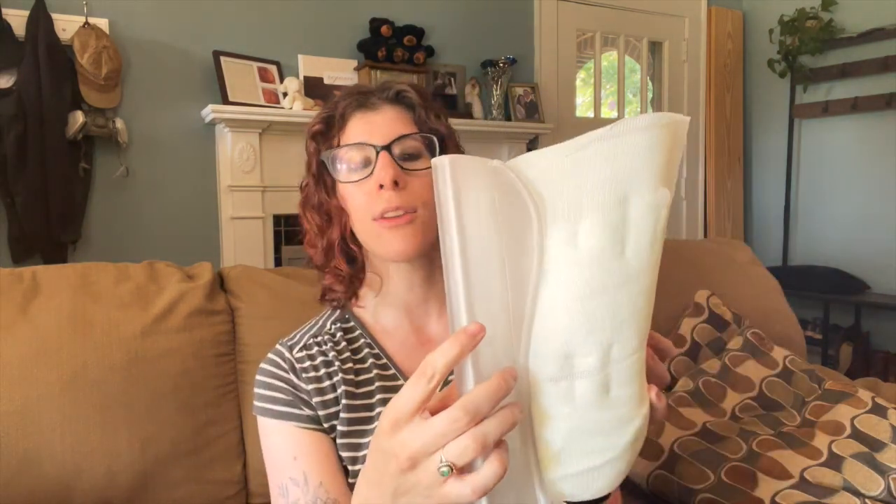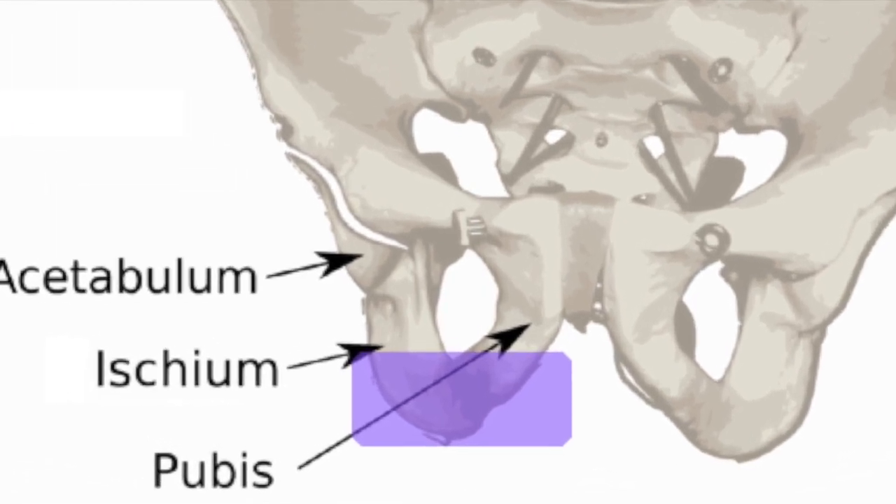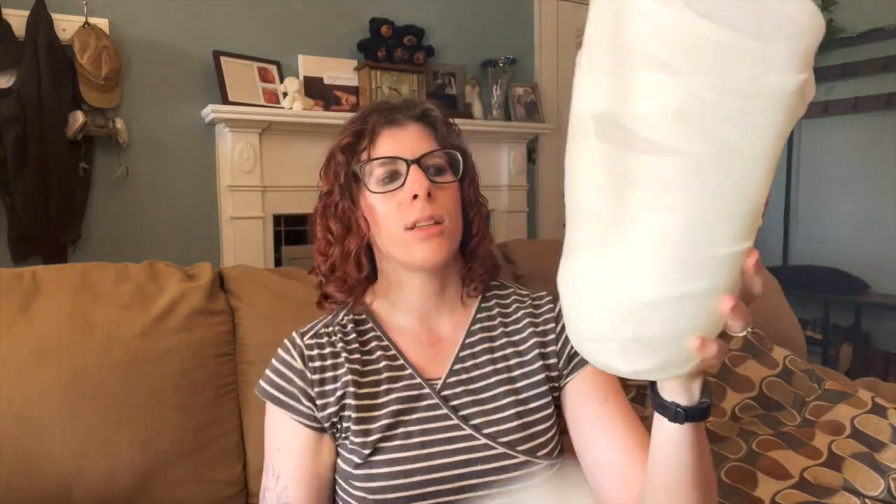This first piece goes right on the front and that creates your scarpus. You've got this medial channel that goes right underneath the sit bone — the ischium ramus. Then this last piece is the lateral channel, and you can see it has a little curve at the bottom. You place that behind the femur just proximal — just above the cut — and you have your built-in distal femur relief right there.